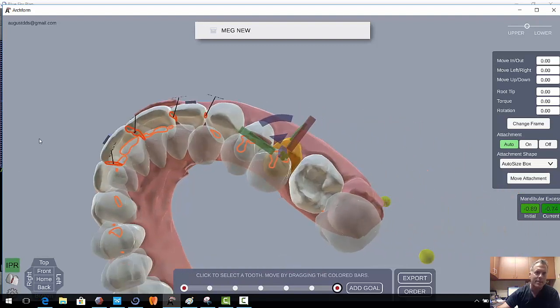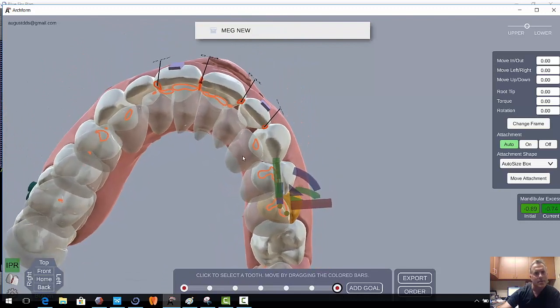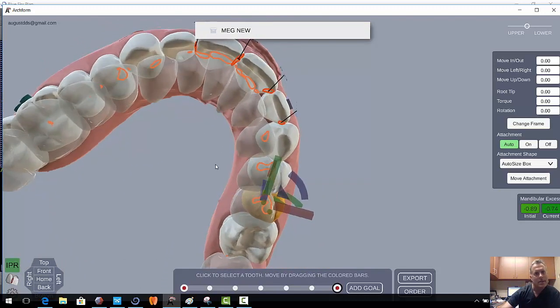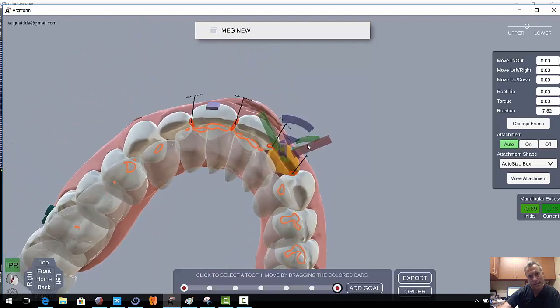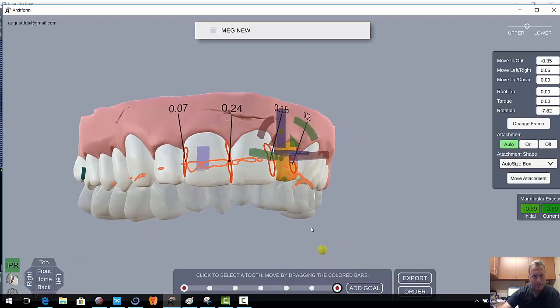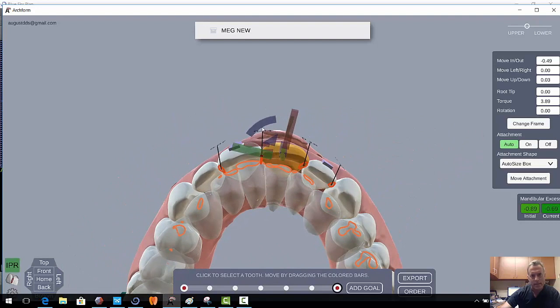I'm just going to click on another tooth so I can kind of look at this and see how things are looking. So we've gotten actually these down pretty good. Let's go ahead and rotate that and move that in just a hair. Let's see if we can do the same with this guy.